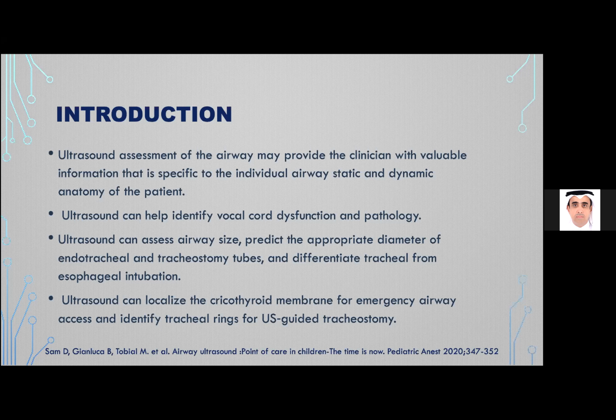The patient will have a short neck, and it's not easy to find good space for the probe to keep it suprasternal. So it's very important to select a high-frequency probe. Then you have to look for one with a very small footprint, to be easy to keep in this small area. So the hockey stick high-frequency probe is one of the good options for you.